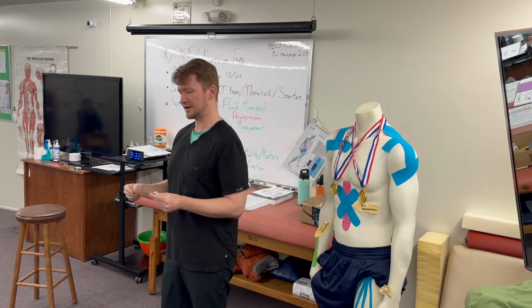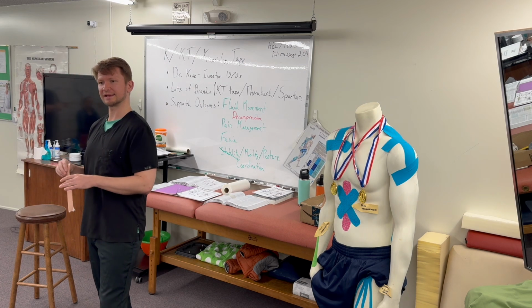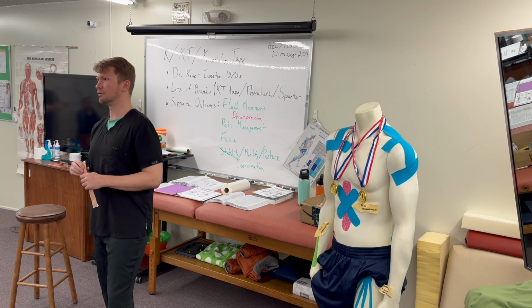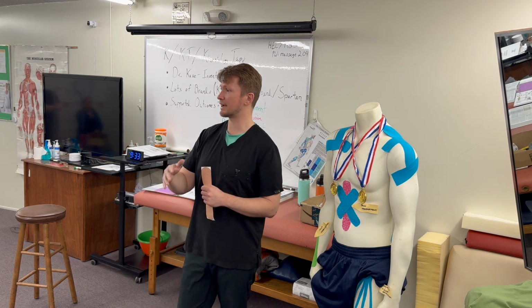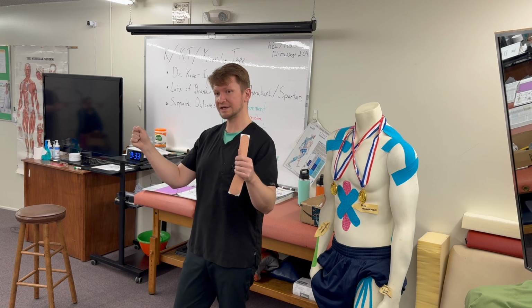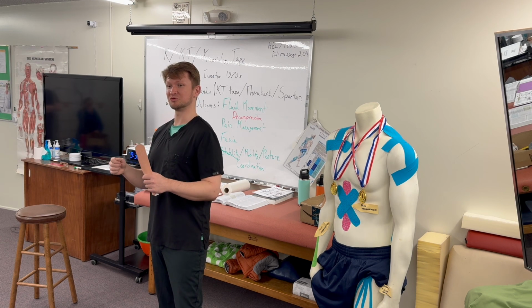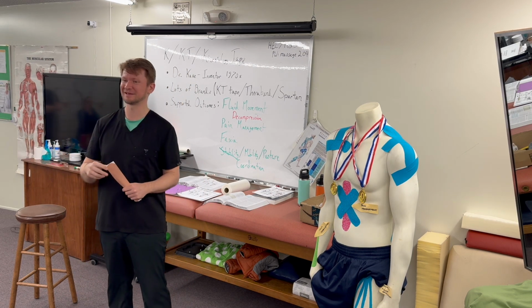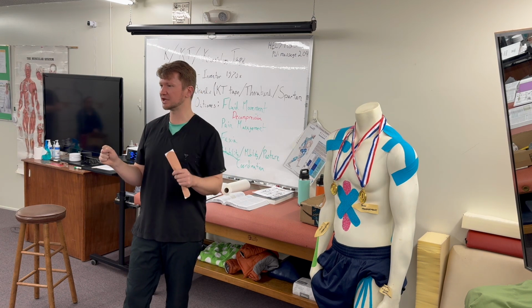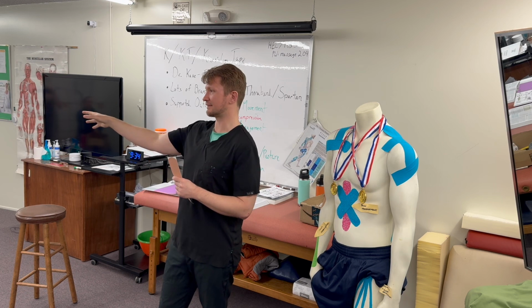There are other brands of stretchy tape out there that aren't quite like this Kinesiology tape. The most popular one is Rock Tape. It's not more popular than Kinesiology tape, but Rock Tape is out there. That is really strong. It's like going from, trying to think, a masking tape to gorilla tape. It's really got a lot more rigidity to it. So it does sit in a middle ground between this and the athletic tape.